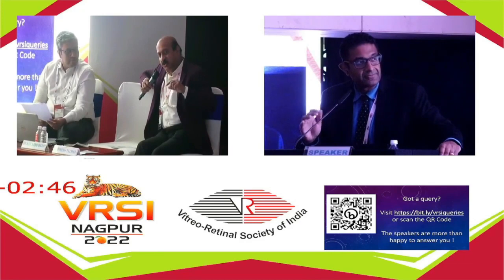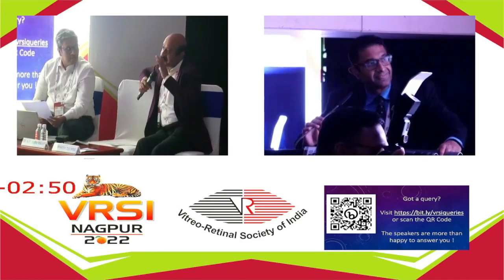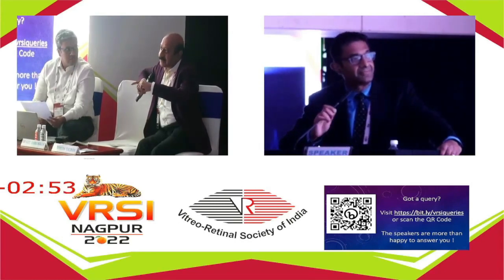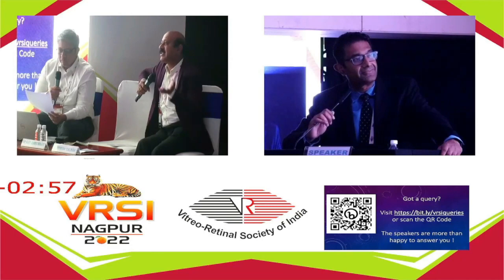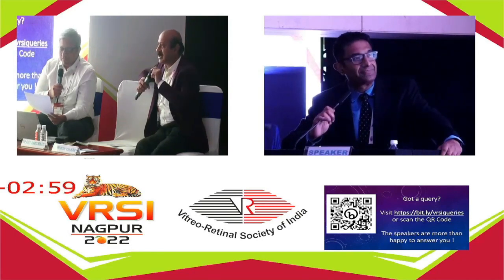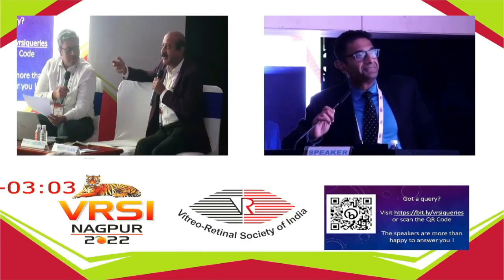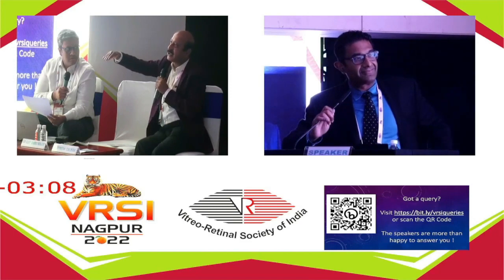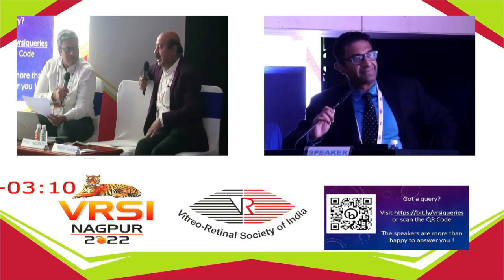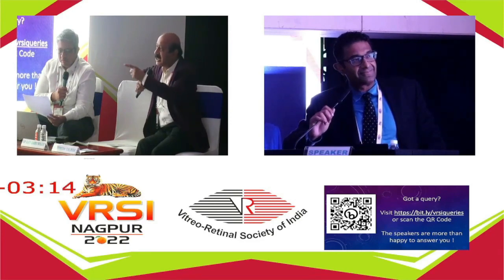Most of us go for wide field first and then examine. A detailed examination is missing in the clinic most of the time, and the new residents are more machine dependent rather than examination dependent, which we need to change. The second issue is the change of versions of the wide field. You invest in one version and the second version comes, and the cost is exorbitant. In clinical practice, it becomes very difficult for practitioners to update their versions.